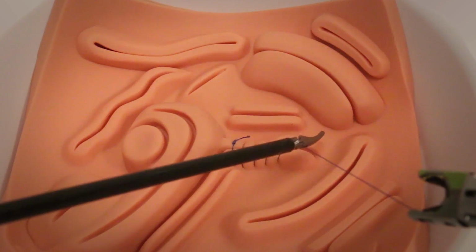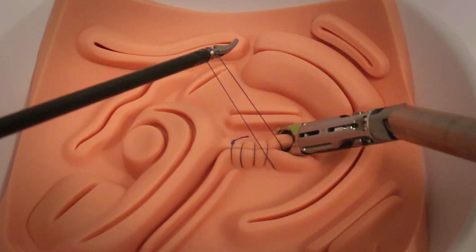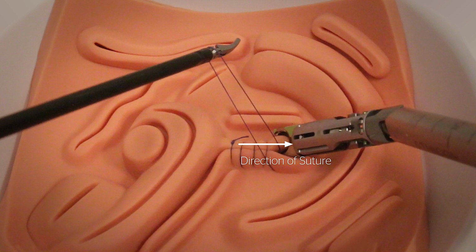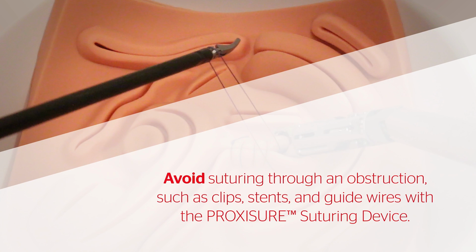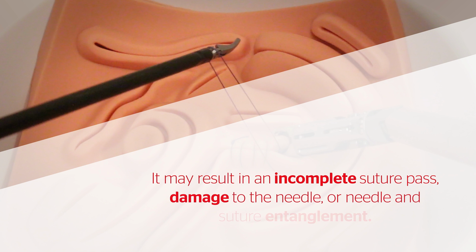As you continue to throw additional stitches, maintain the suture tension in the opposite direction of the continuous suture line. This will prevent the suture from getting locked. Avoid suturing through an obstruction, such as clips, stents, and guide wires with the Proxisure suturing device. It may result in an incomplete suture pass, damage to the needle, or needle and suture entanglement.